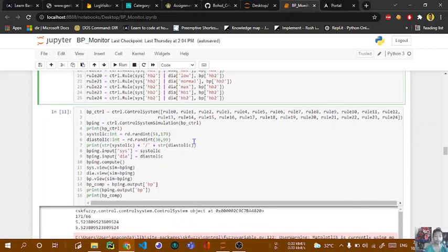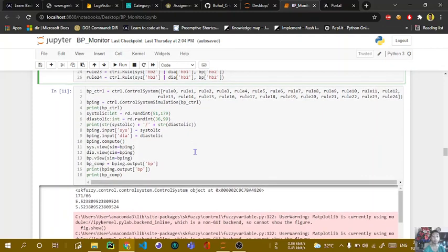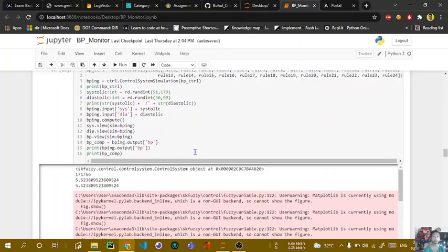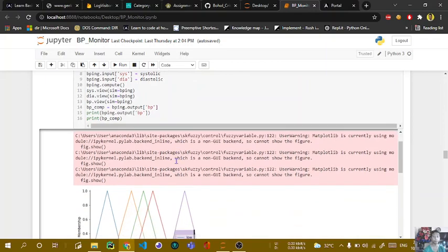So here in our program, instead of inputting different numbers, we just randomize it. Systolic is randomized from 51 to 179, which is inside the range, and the diastolic is 36 to 99. After that, we show the figure of the systolic and diastolic, and also the BP.